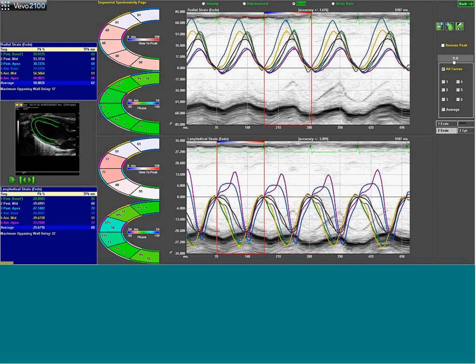I remember where that button is now. There's an R to R button here that allows you to jump to the different cardiovascular cycles. So you can cycle through and look at the different cycles, based on the R waves that the system has traced out. So you can just cycle through and look at those averaged. Again, these are all exportable as well, so these data are exportable to CSV files. So you can get those data.